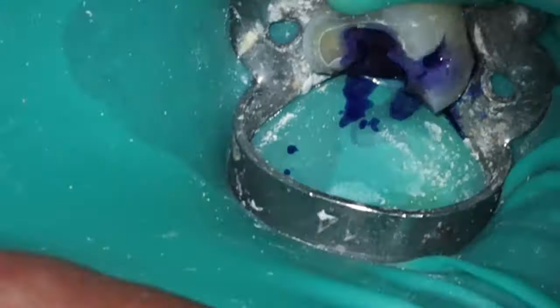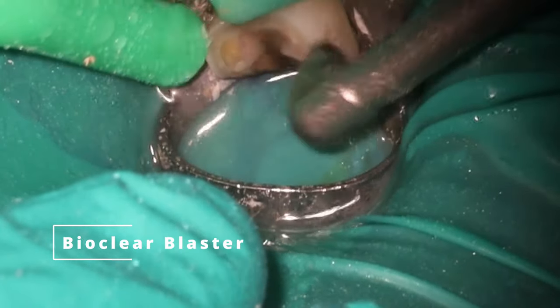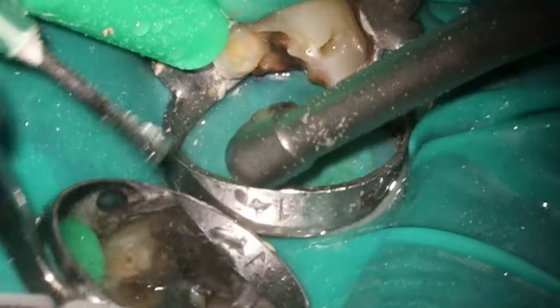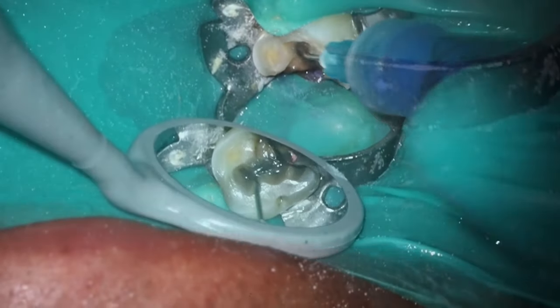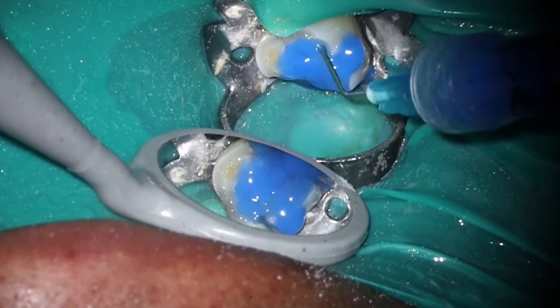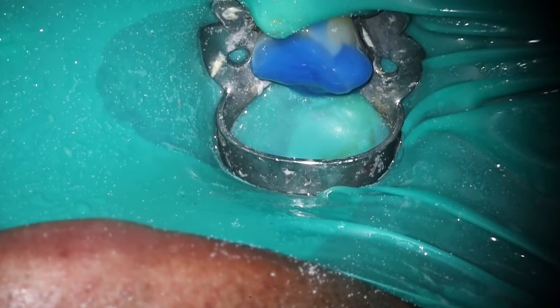Using a burr to clean up gutta-percha is sacrilege to a lot of people — be very careful because you can gouge it. But if you are careful, it does leave a beautiful flat surface. Starting the restorative process — using the Bioclear disclosing solution to figure out where everything is. I noticed there's still a little piece of amalgam in that buccal pit, so I'm going in to quickly zap that with the diamond just to knock that piece out. This is all going to get prepped out when the patient gets a crown anyway, but I like to make my x-rays look as good as possible.